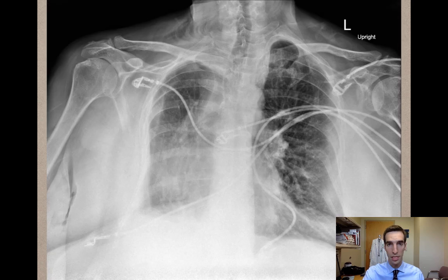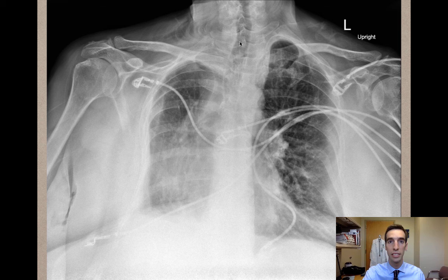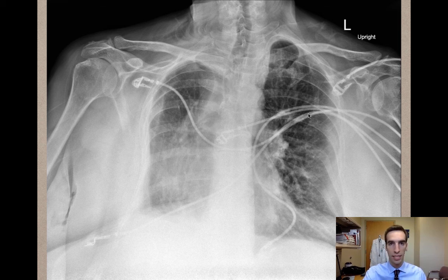So let's take a look at an example. This chest x-ray shows that the airway, or the trachea, is deviated laterally, and there's some haziness or congestion in the lung fields.